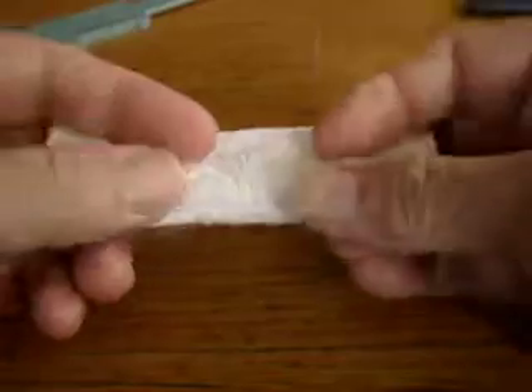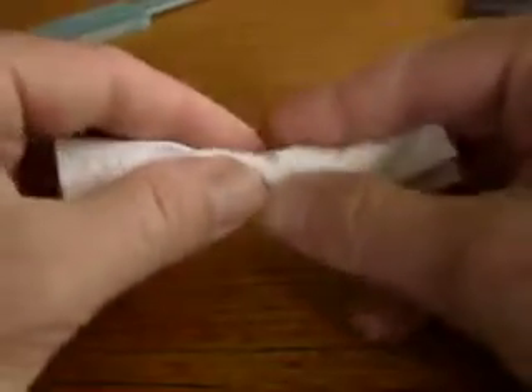I thought I'd do a quick demonstration of how I stopped the bleeding on my finger after I've got a good drop of blood.